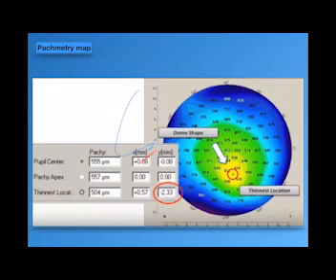The second point to study in the pachymetry is the relation between the corneal apex and the thinnest location, which is called the Y coordinate. The Y coordinate is the deviation of the thinnest location from the corneal apex, which should be less than -1.